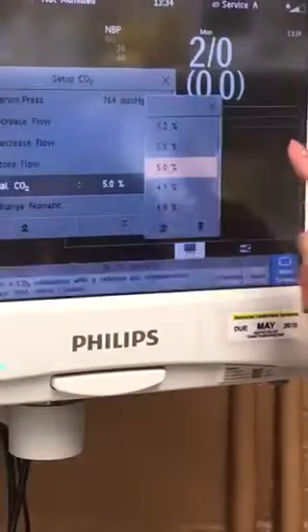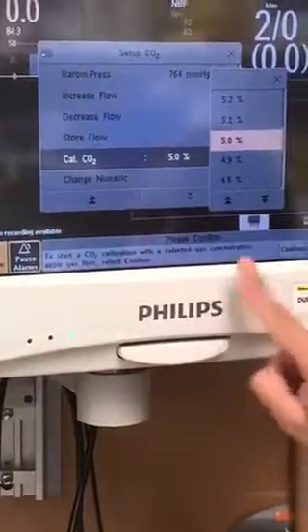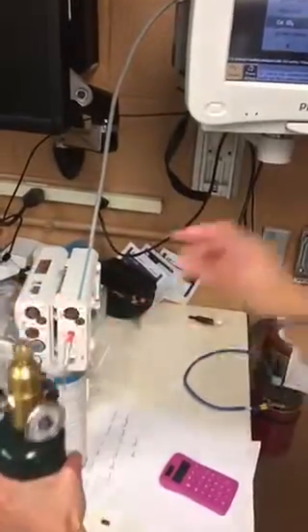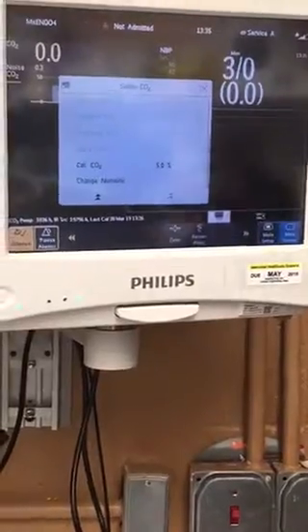5% is what we have. And then it says to start a CO2 calibration with a selected gas concentration, apply gas first. So we're going to turn the gas on, and then we're going to confirm. It takes about 30 seconds.